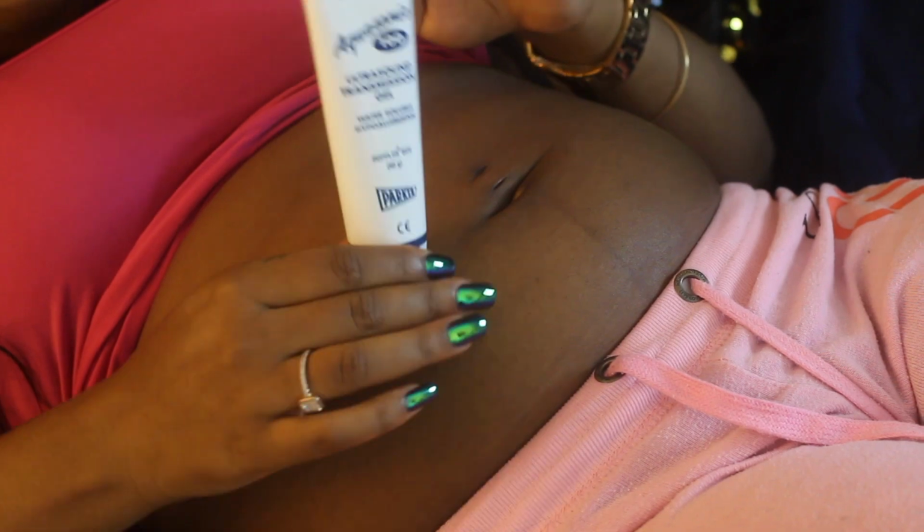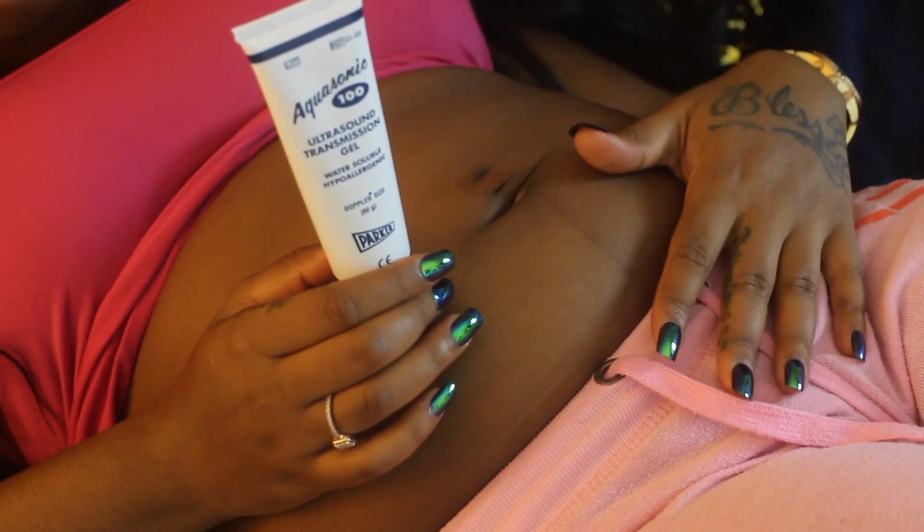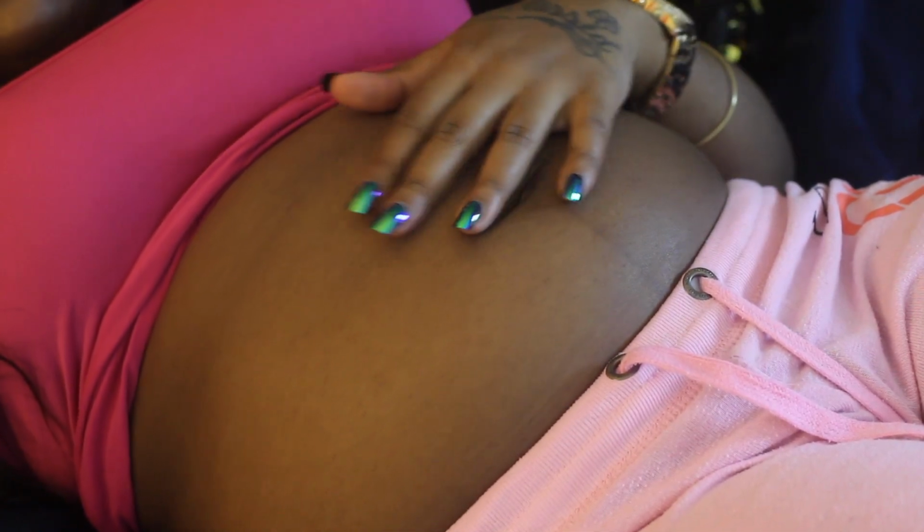You want to make sure that you use enough gel. Most people say that they have better luck at finding baby on a full bladder and with their pelvis up, but I've had no issues finding baby either way. I got my Doppler when I was 11 weeks, and I found my baby literally down here, near my pelvic bone. But 2 days ago, I found my baby right here. So this is where I'm going to start off, in this region, trying to find that little mover, because literally now she's moving. I'm sure she knows what that thing is, and she moves away now.